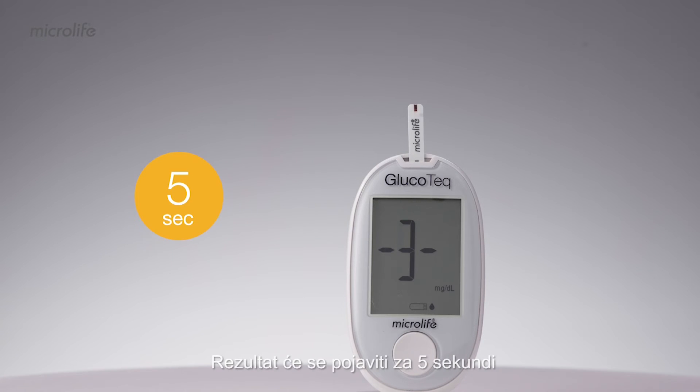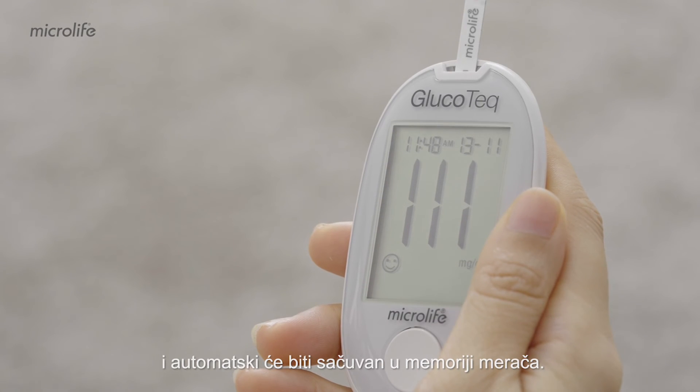The result appears in 5 seconds with a date and time, and it will automatically be stored in the meter memory.